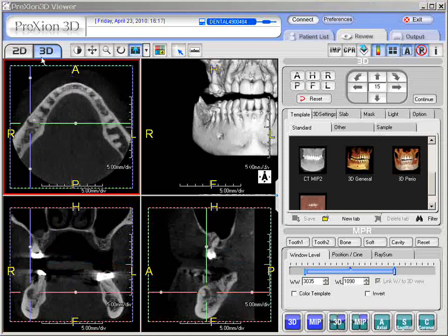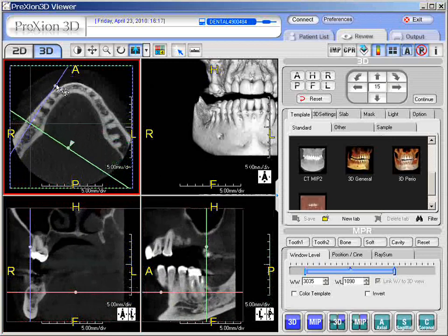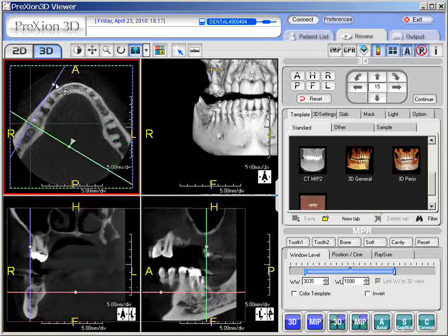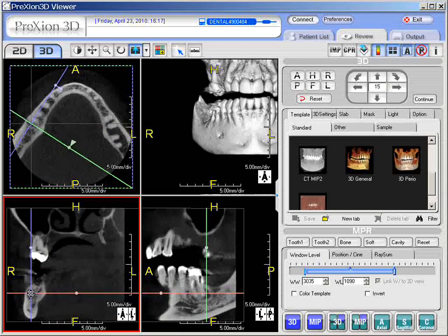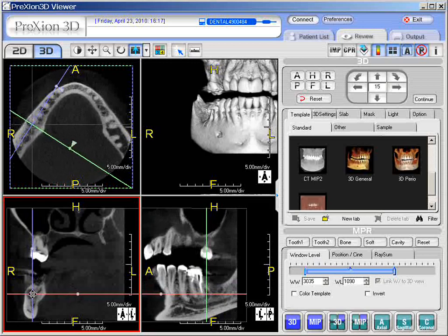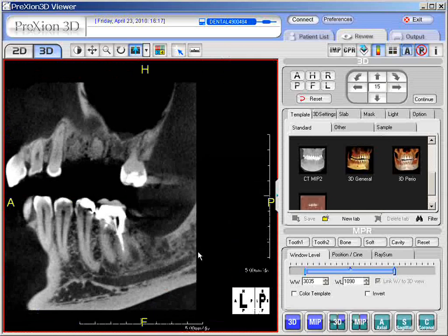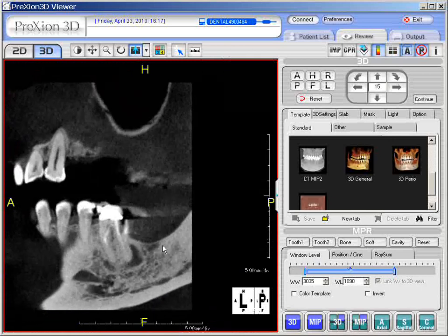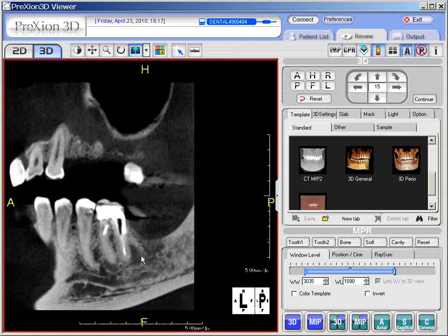Then go up into the axial plane, grab the anchor point on the crossbar, and align it so that you can see the blue line on the right side. You may also click the center part where the crossbars meet and go back and forth — whether buccal or lingual — to evaluate in all three planes. At any plane, double-click and slice with the middle wheel to get an evaluation of a particular area.